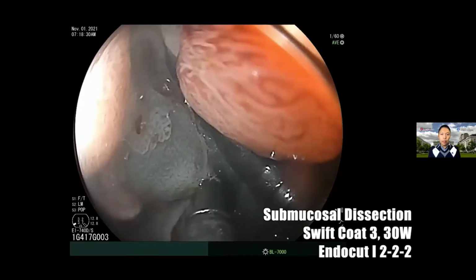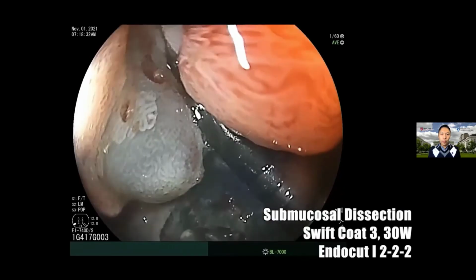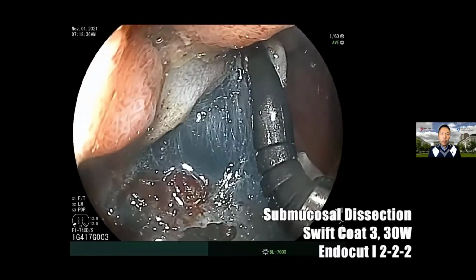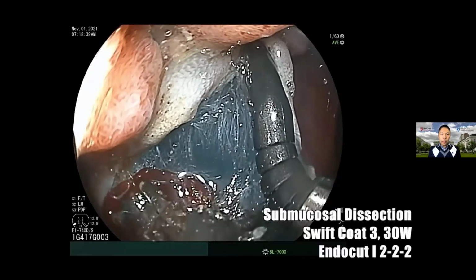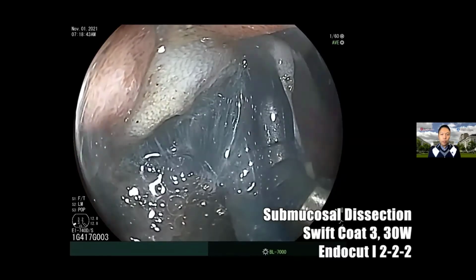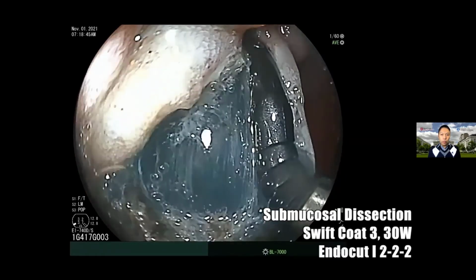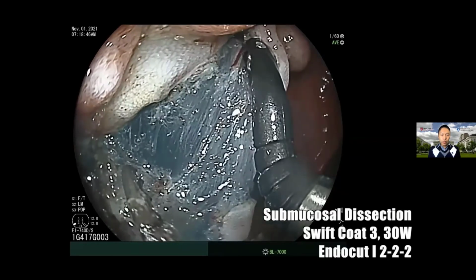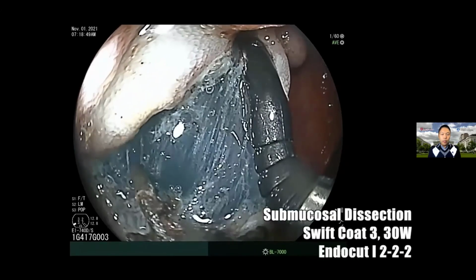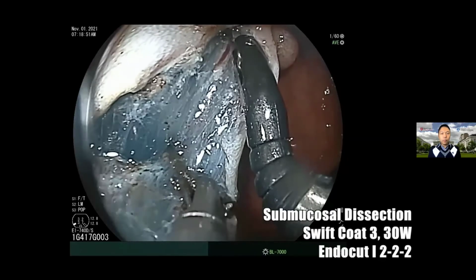And then also the other thing is this re-grasping capability and repositioning capability. With the clip and band traction technique or other traction methods, once it's deployed, we cannot change the location of the traction, and also the force and the direction. So this is the biggest advantage of using this articulating device as your right hand.